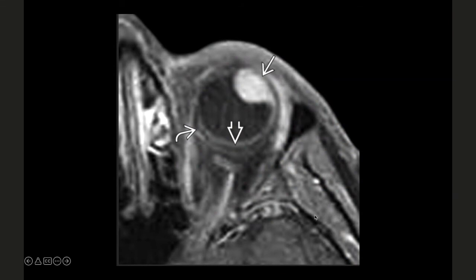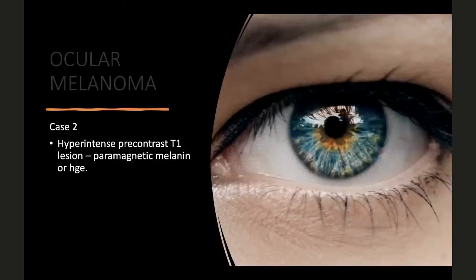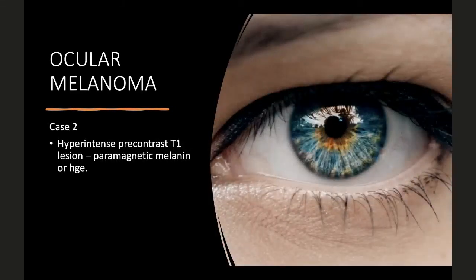And then this is a post-contrast study because I can see a lot of enhancement, and I'm telling you it's post-contrast. So something is enhancing. It's from the wall. The sclera is this outermost dark line. That's why I told you that, right? And then this choroid, remember it's vascular, so it's going to be enhancing. So this thing seems to have a choroidal tail, and it's a mass involving the choroid. Melanomas are vascular lesions. They like structures with good blood flow. It's going to go to the choroid. This is a known choroidal ocular melanoma.